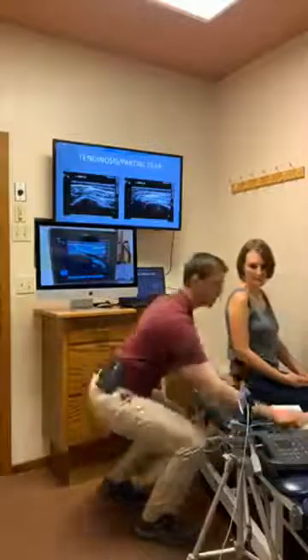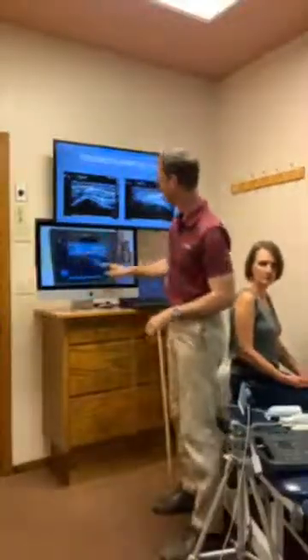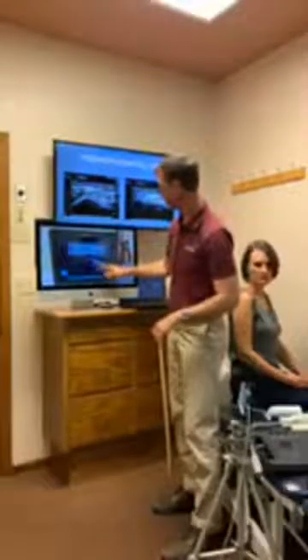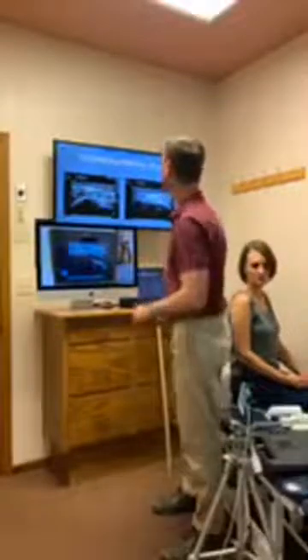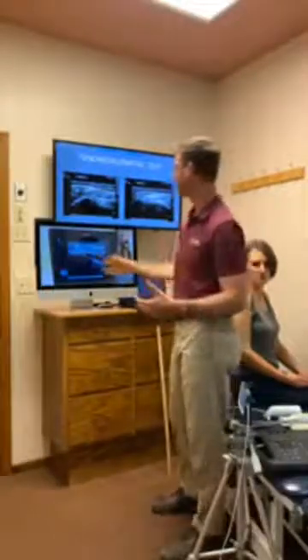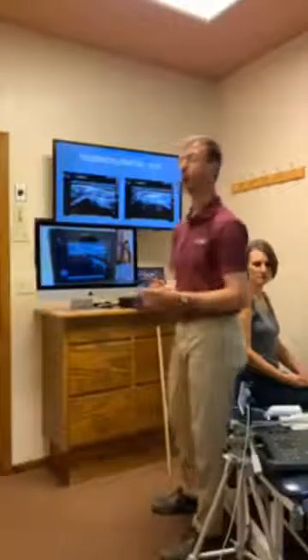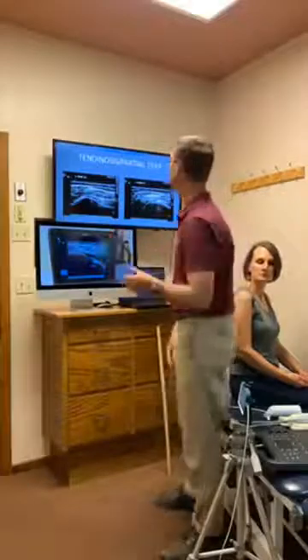All right, so here we have the head of the humerus. Here's your infraspinatus tendon. This is the outline of the socket, if you will, and then the labrum's right in here. Okay, the labrum is that fibrocartilage ring again that we talked about. Not diagnostic, but in this view we do actually see a bit of it. If there's a problem, you can kind of get a sense of it, but then they need further testing.